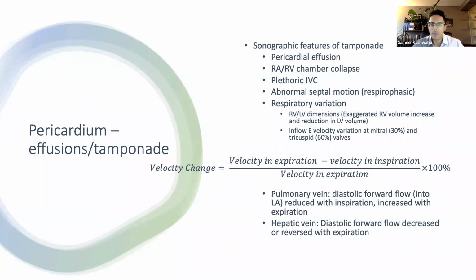There's many sonographic features of tamponade, some of which were described in that last echo. So certainly a pericardial effusion has to be present. It can sometimes be difficult to differentiate from pericardial fat or a pleural effusion, depending on how good the images are. We often see chamber collapse, most commonly in the right atrium, which is the most sensitive feature in terms of chamber collapse. And we sometimes see right ventricular collapse in diastole, which is relatively insensitive, but a more specific finding of tamponade. On occasion, we'll also see left atrial or left ventricular collapse, but they're very rare, but quite specific for tamponade if they occur.